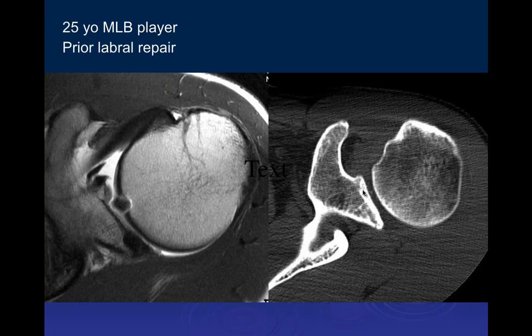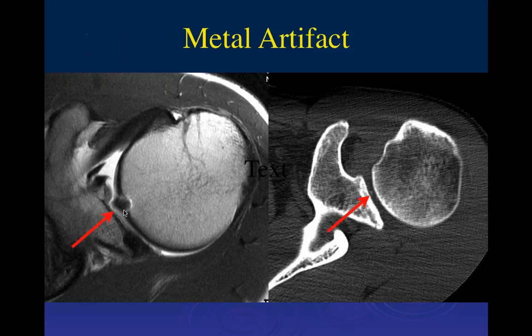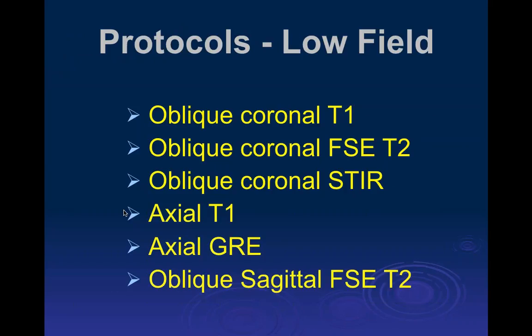But be aware that these can be a problem. I'm involved right now with one of our referring physicians, trying to help him out, where he's actually being sued because of this, and it's not a malpractice in my opinion. So that's a metal artifact you're familiar with.